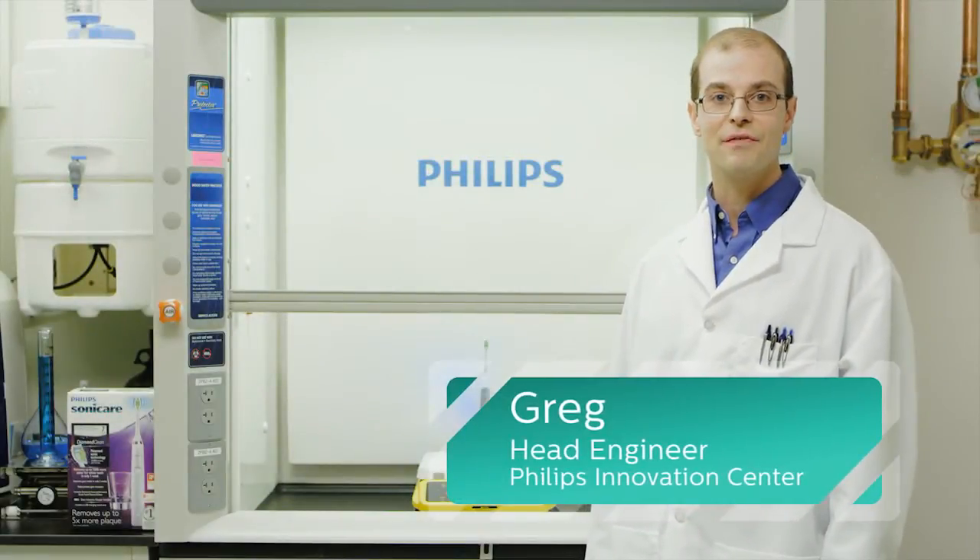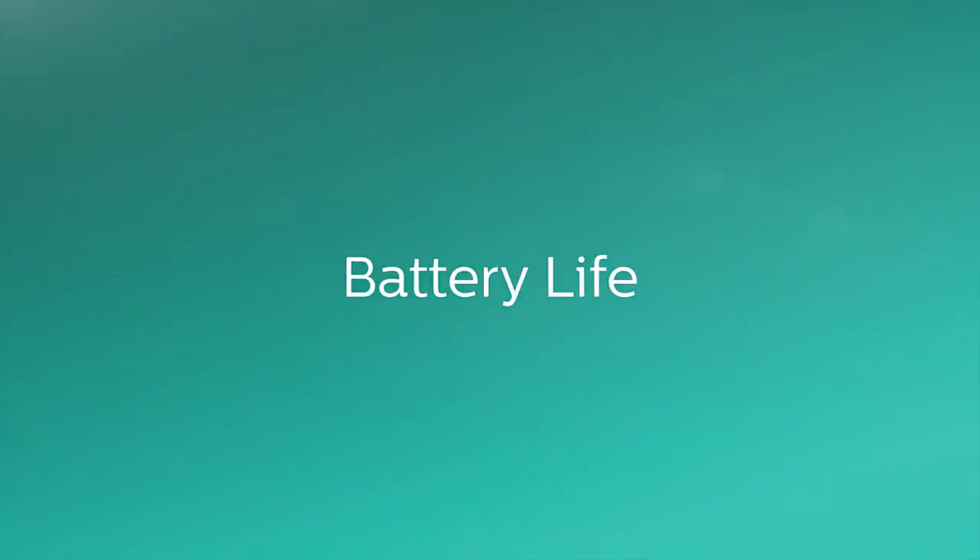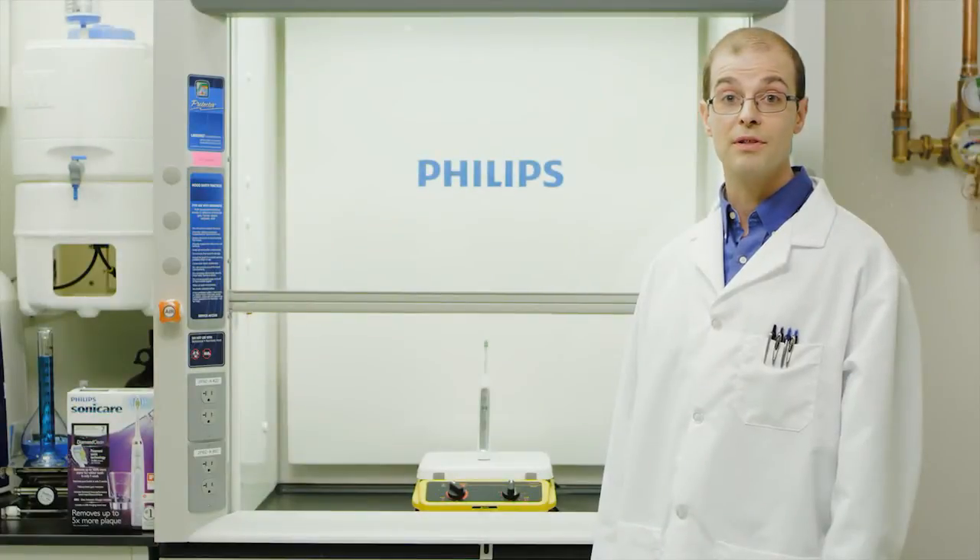Hello, I'm Greg. I'm the lead engineer at Philips Innovation Center. Have you ever wondered about the battery life of a Philips Sonicare toothbrush? Let me show you what happens when I put it to the test.